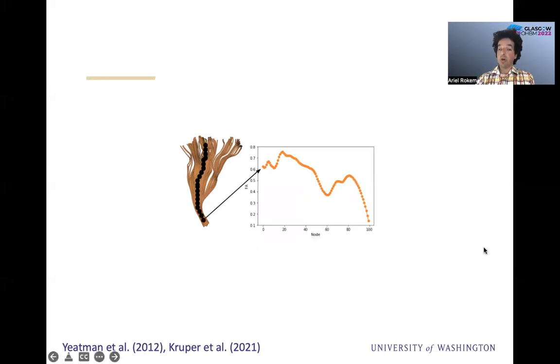And so at the bottom of the corticospinal tract, we might find the fractional anisotropy, or FA, to be something like 0.6. Then we sample the next point and the next point and so on until we get what we call a tract profile. This is the properties of diffusion, in this case, the fractional anisotropy, along the entire length of the bundle. And as you can see, the fractional anisotropy varies along the length of the bundle.